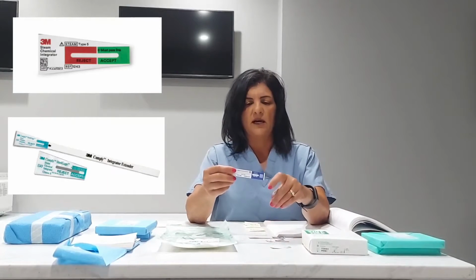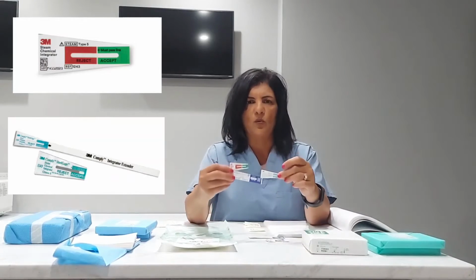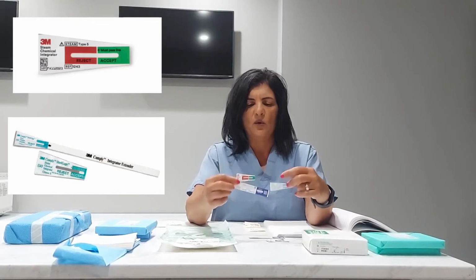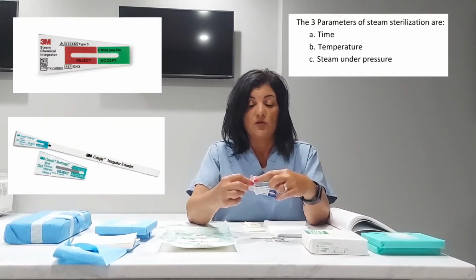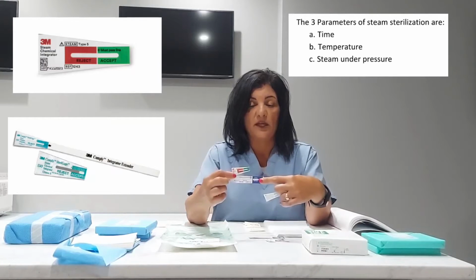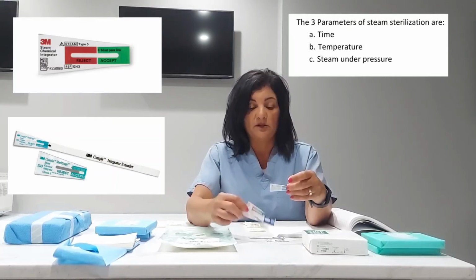There's this one, some of them have tails so that you can find them. There's this green and red one. There's this blue and white one. They're pretty much a window. Once it's been exposed to the time, temperature, steam under pressure, these windows will go from white to black, and it has to go all the way across into the acceptable range. So these are reacting to all three parameters.